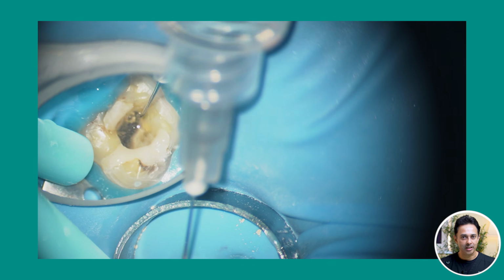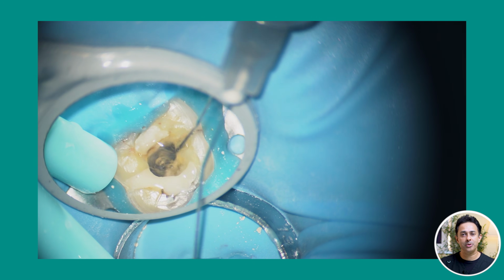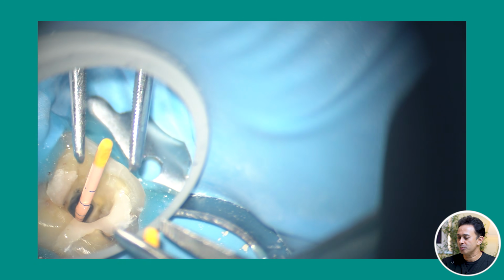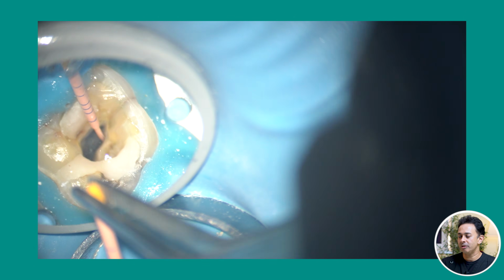To start with, sodium hypochlorite is the primary irrigant. We use sodium hypochlorite continuously, copiously. We use it continuously, but we don't introduce any other irrigant. We use it till the stage where the master cone is selected. Once the master cone is selected and we are about to obturate, that's when we introduce some water first. We rinse the canals with water, carry water with the master cone to working length into the canal, and then we leave it for a minute. The goal is to try and neutralize whatever hypochlorite is there in the canal.